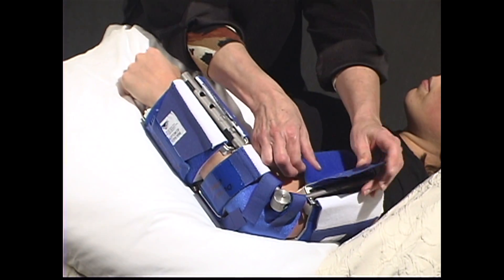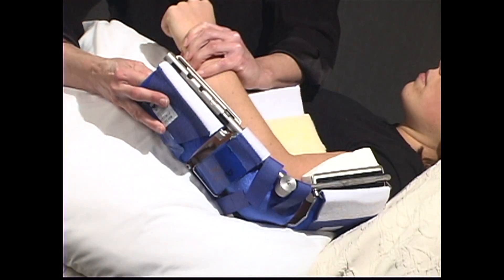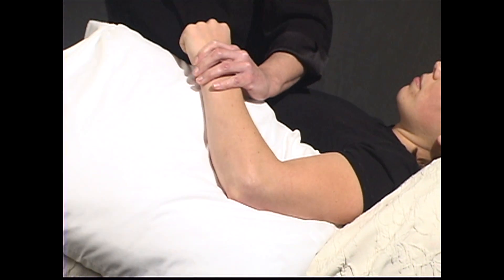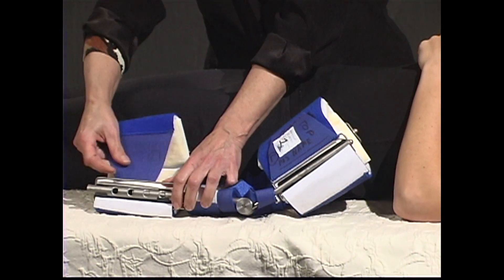To remove the elbow extension DynaSplint, unstrap both front cuffs and gently remove the patient's arm. Please reclose all straps and cuffs when the DynaSplint is not in use.